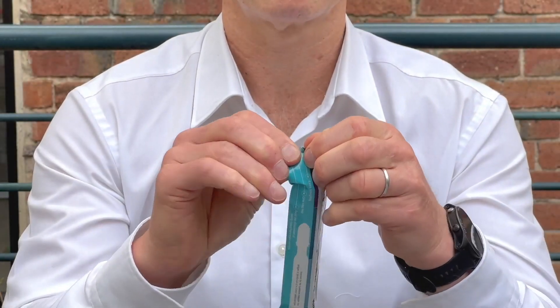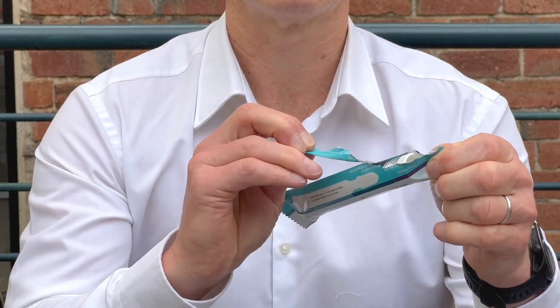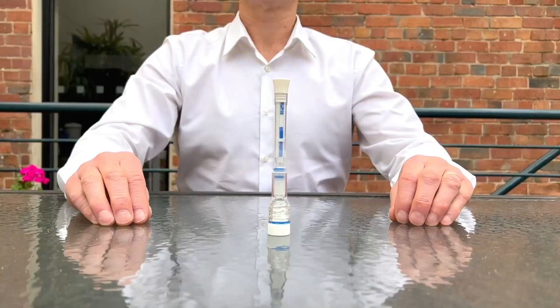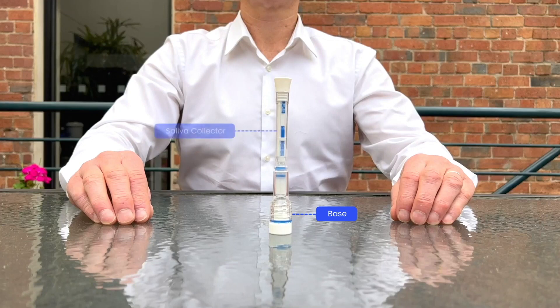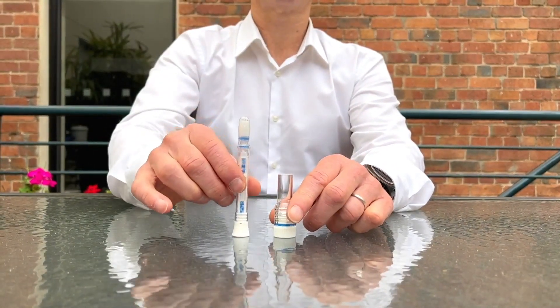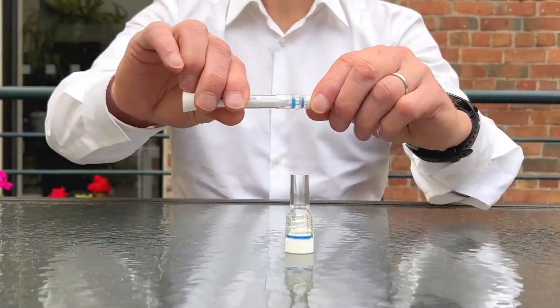Remove the test from the packaging. Please see the base, sample collector, and protector. Take the sample collector out of the base and remove the protector.